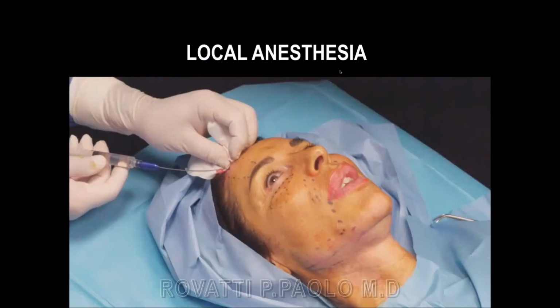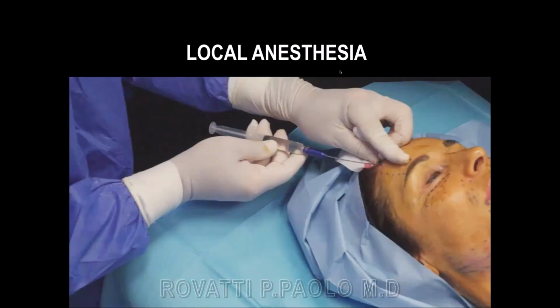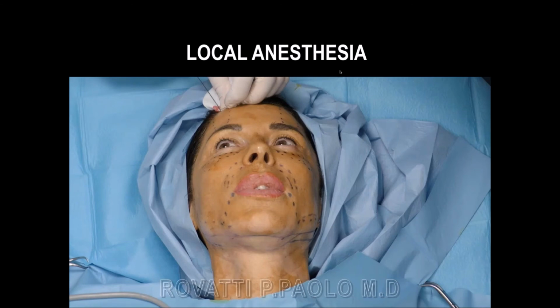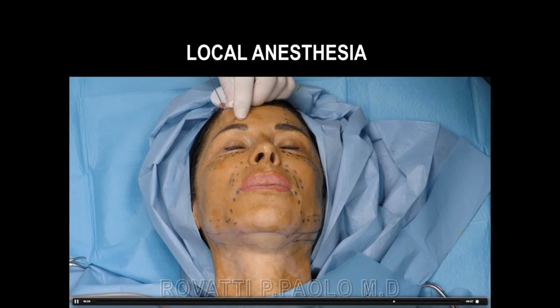Just to show you something, this is the local anesthesia, always with a cannula, and I usually use 4 or 5 milliliters of the mixing solution of saline solution and lidocaine. You can see that I have an undermining of my tissue, of my muscles, and after the anesthesia, I can treat. Look, the patient is not sedated, I gave her nothing, it's just a very slow infiltration. You don't have any pain, it's not a painful treatment. And after this, you can start to treat. And now you will see.